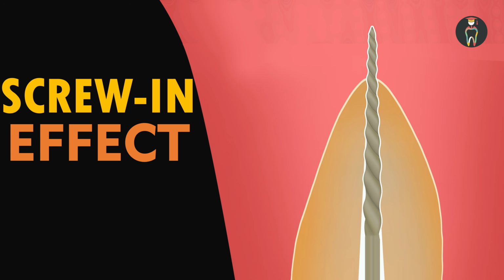It should not be a rough canal preparation with whatever file is available. Always understand the file design, and then you can master the field of endodontics and make your patients super happy, because the file going beyond the apex is the most important cause for apical violation and also for post-operative pain.